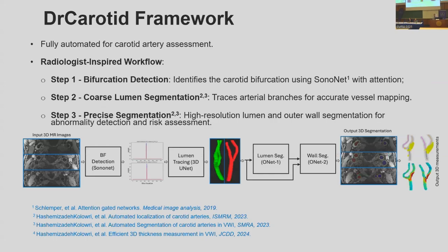And then this actually migrated into something else because of Dr. Carotid, this is more recent, and this was developed by a research fellow in Utah. The intention is that you can identify where the carotid bifurcations are in the images automatically, and segment the lumen and outer boundaries automatically based on algorithms, and these are neural network-based algorithms. Then we can calculate the thickness along the arteries, in this case using a Laplacian transform algorithm. And then this is the result.